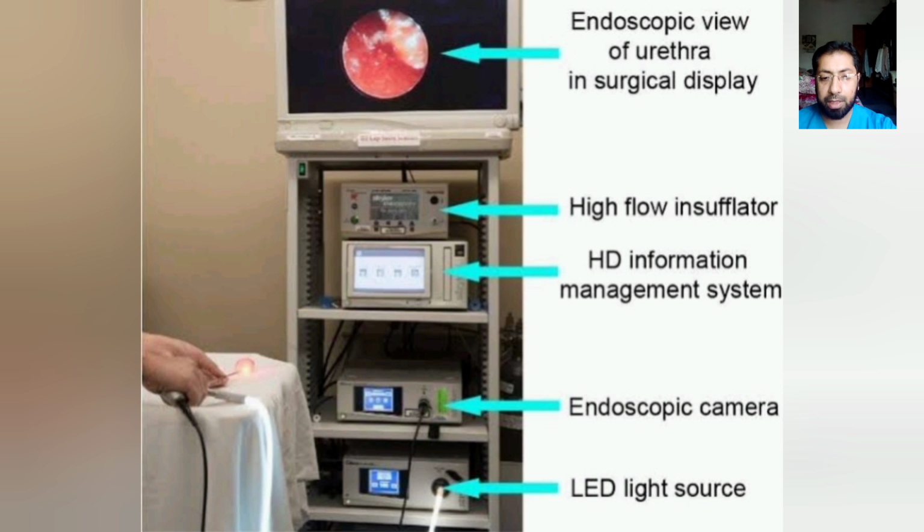Another factor one should consider during trocar placement is that instrument length is limited. If the trocar is too far from the desired position, then one has to push the abdominal wall toward the target organ to gain a few centimeters. This not only makes movements less precise but also causes strain on the fingers and hand.